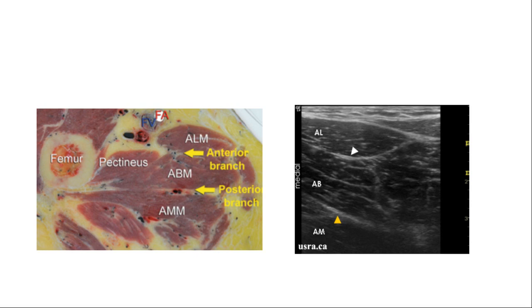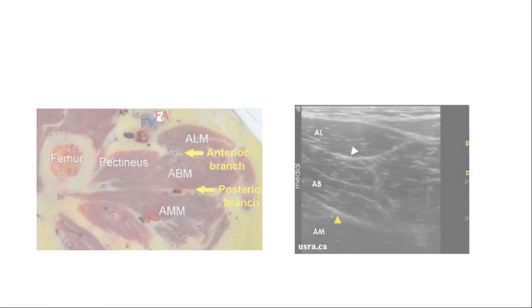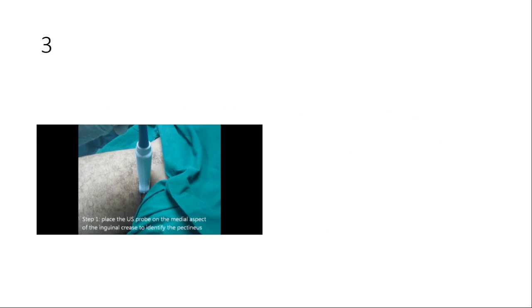Either scan for these hyperechoic areas or directly place local anesthetic in the interfascial plane and the block will work. This second approach also requires two-point injection with 5 ml to each division, similar to the first approach.